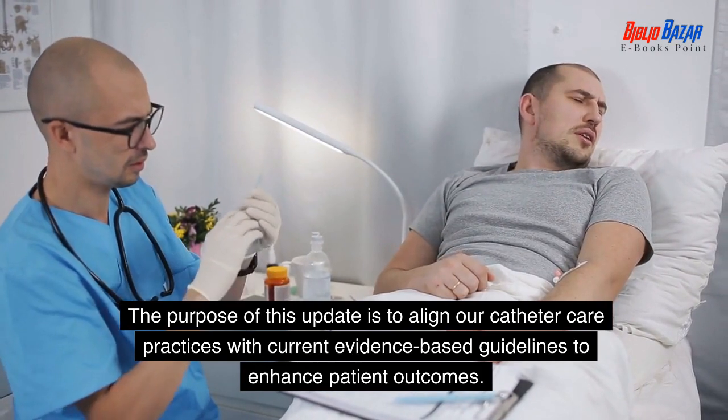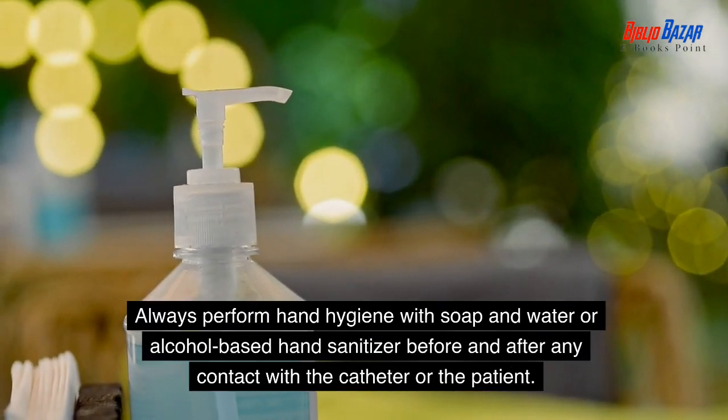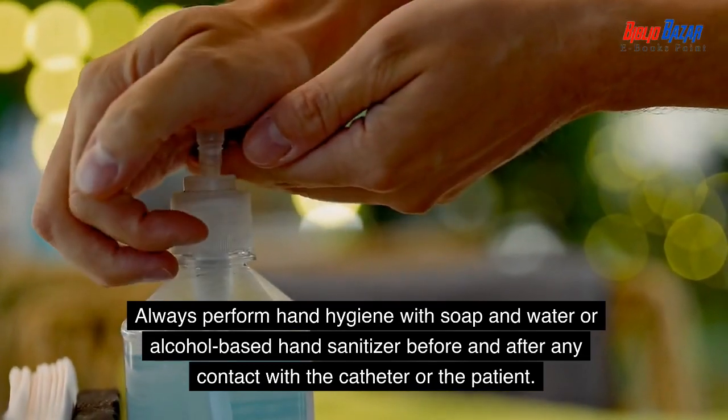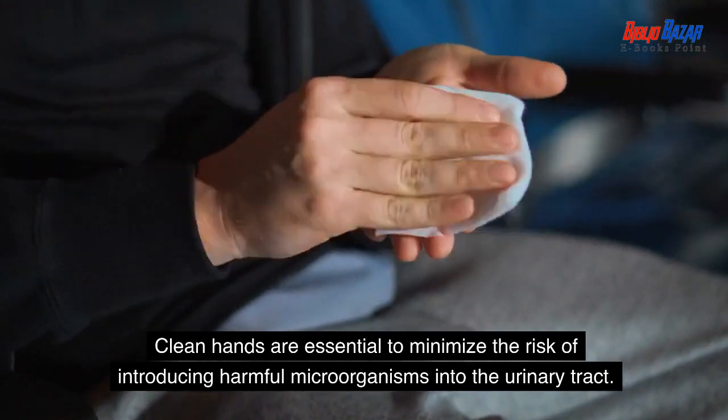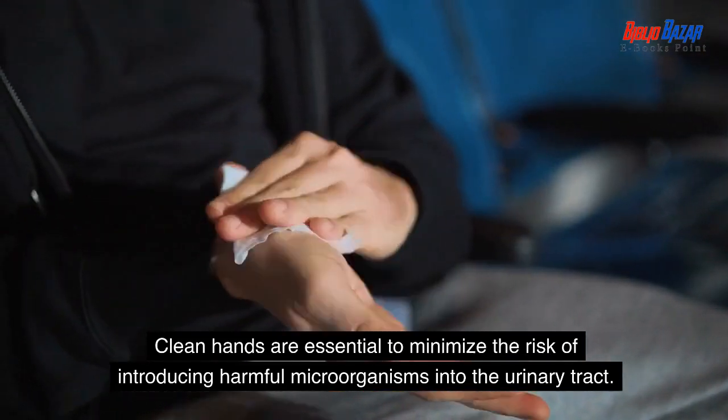Always perform hand hygiene with soap and water or alcohol-based hand sanitizer before and after any contact with the catheter or the patient. Clean hands are essential to minimize the risk of introducing harmful microorganisms into the urinary tract.